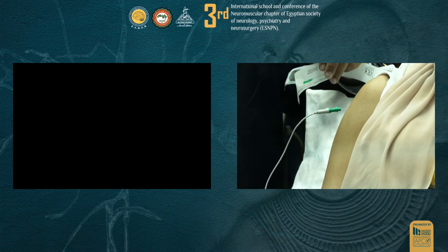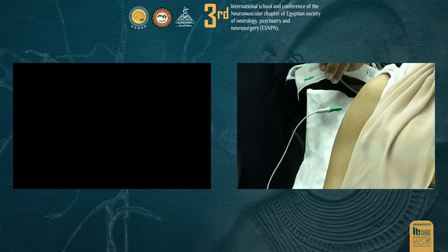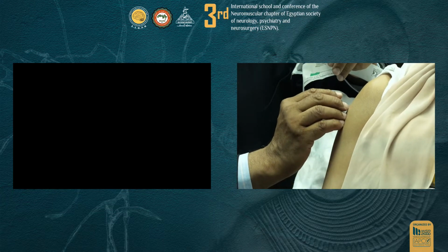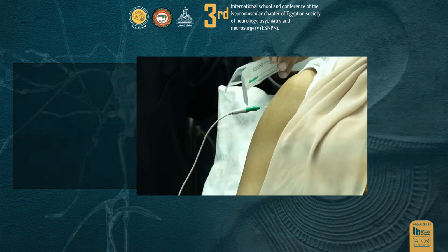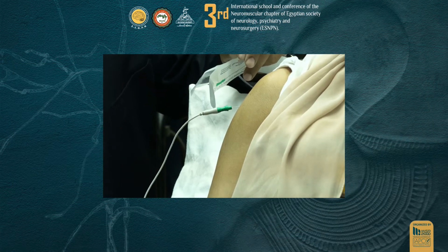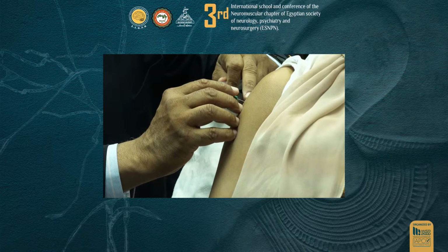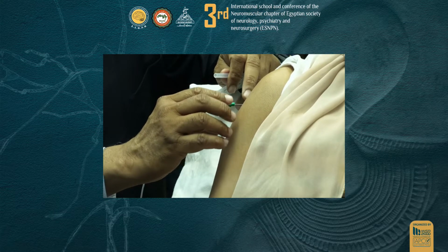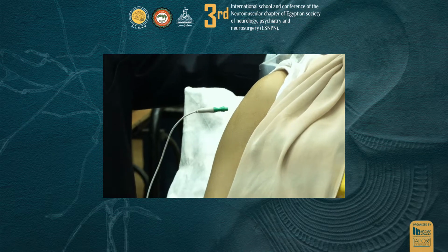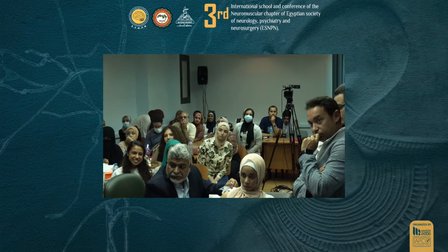Okay, guys, you'll have to stand up. Push against my hand. No, it's not connected. No, it's not recorded. I think the problem is when you connect it to the screen, whatever. But it's at least better than what I was getting before. Okay, so I think we got a better signal. I'll show you some of the basic principles. Okay, we'll put it away.